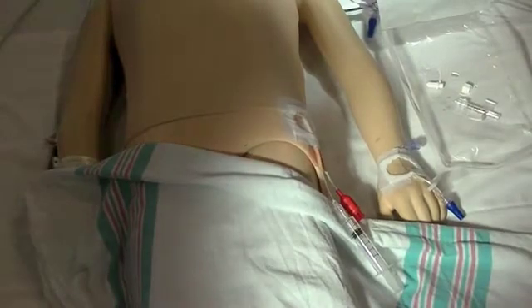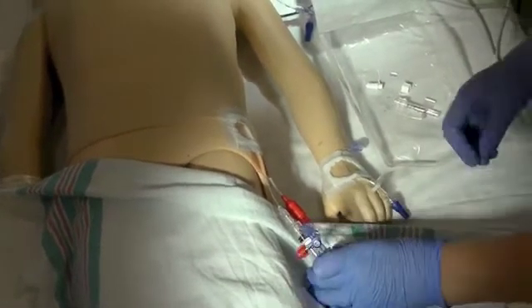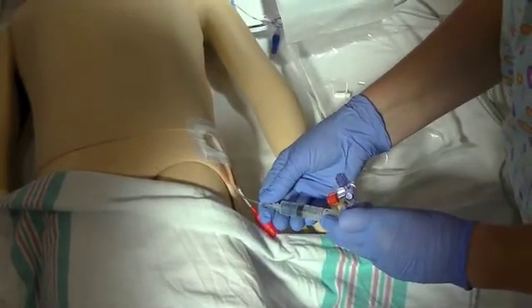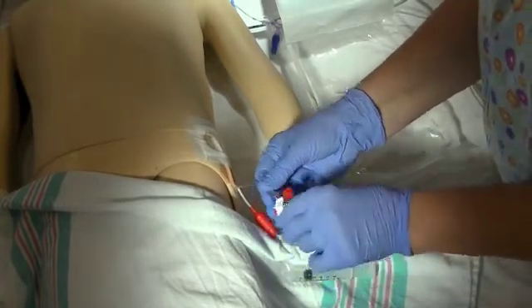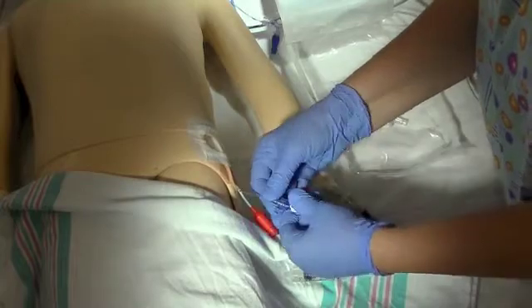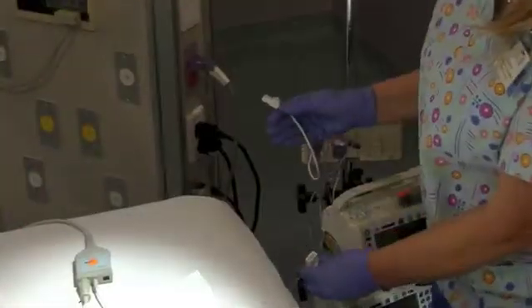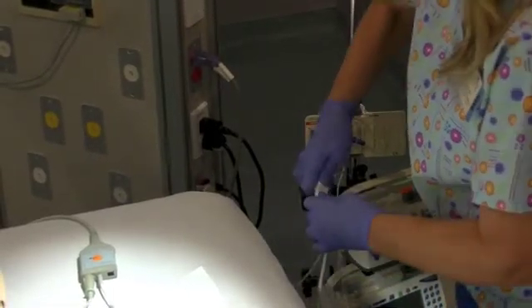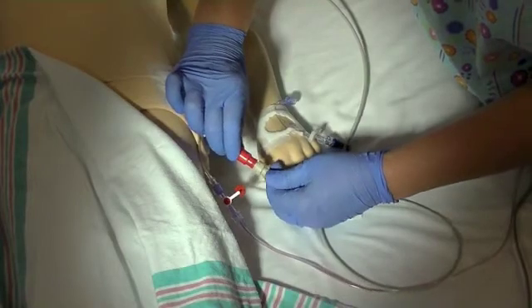Now let's get ready to connect the system with the already placed PiCO arterial catheter. Verify blood return, flush, and clamp before disconnecting. Attach the transducer setup, then unclamp the tubing. Connect the transducer cable with the PiCO pressure cable, and finally connect the end of the thermistor cable to the red thermistor connector.